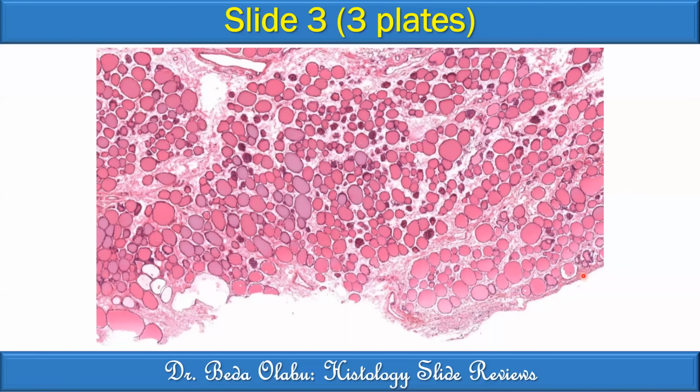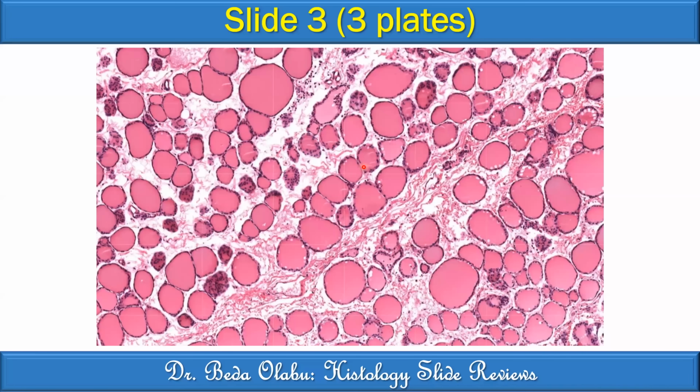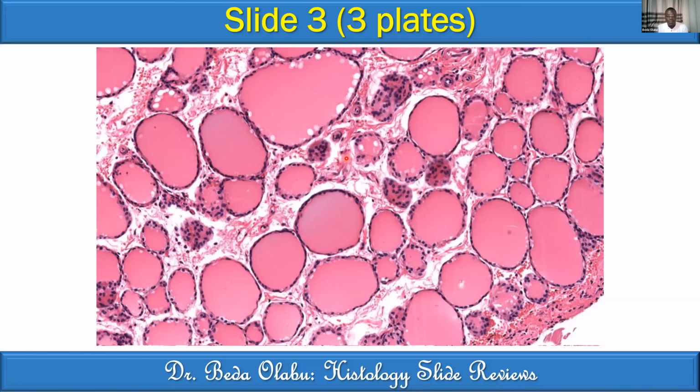Then the second magnification. If you look at the follicles, they have the follicular morphology. The cells have a ring surrounding it, and then at the center we have a homogeneous material. Very good. All right. Last magnification. Anything new? Nothing. Okay, good.